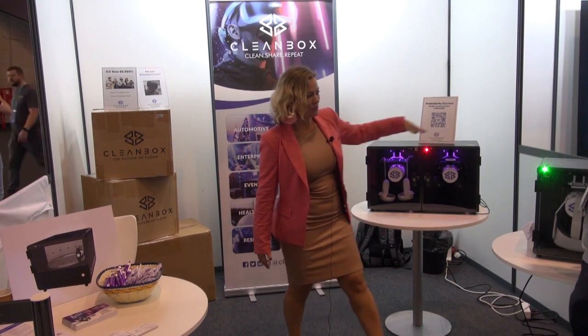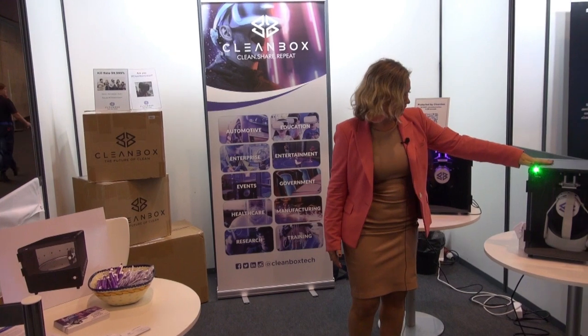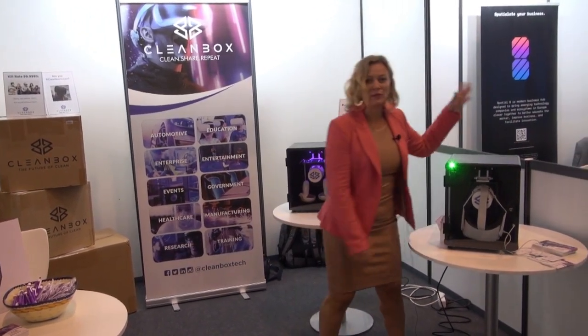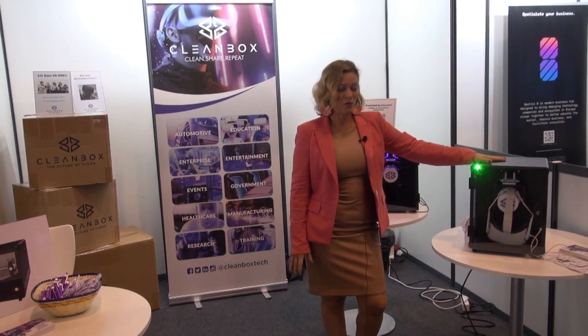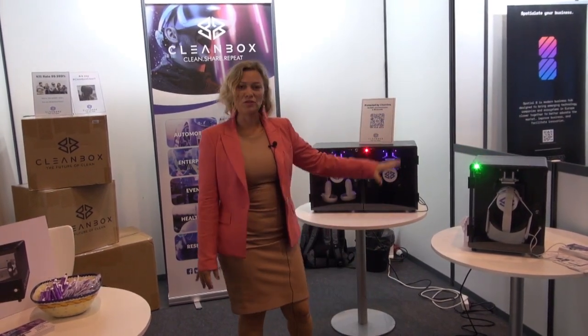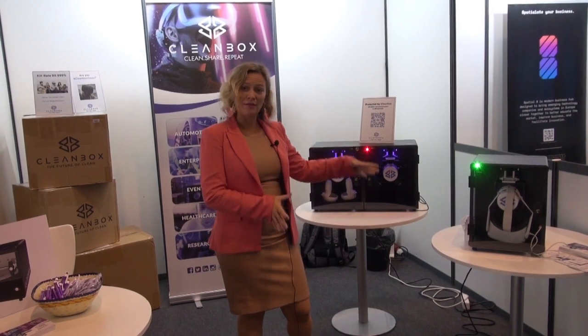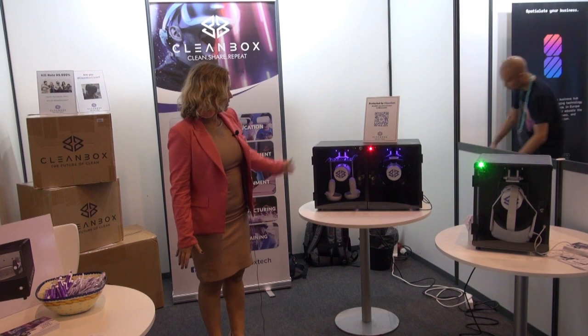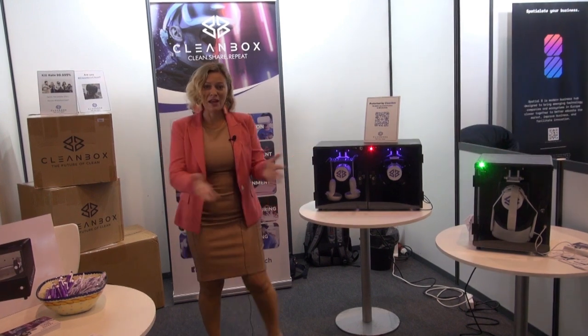This is a CX2 and this is a CX1 for a single unit. They're also portable — very, very lightweight. You can run them on a battery pack if you're someplace where you have limited power outlets. They can also be transported in our custom travel cases for each, and they can take on a plane anywhere you go in the world.